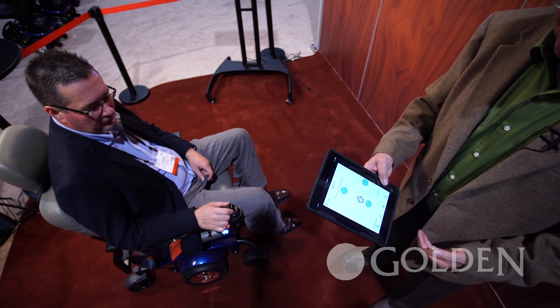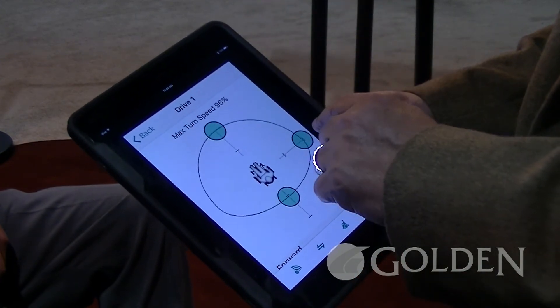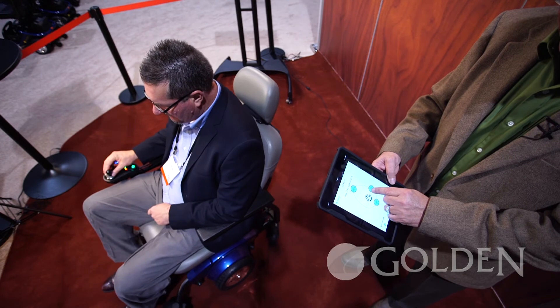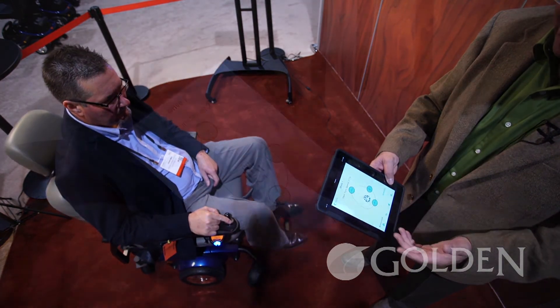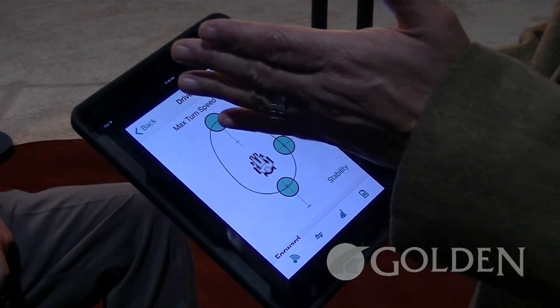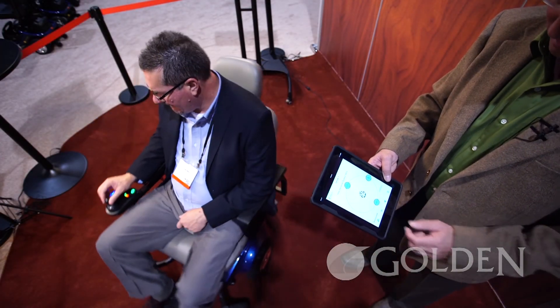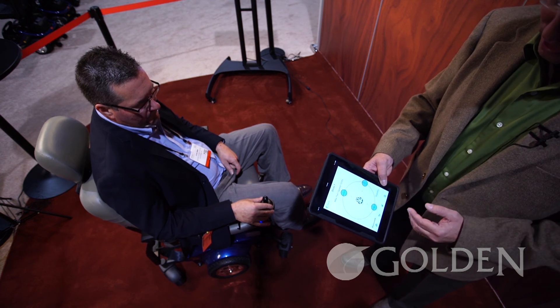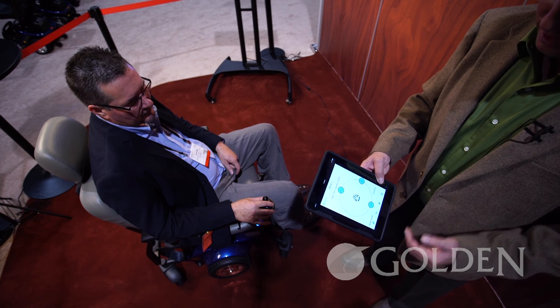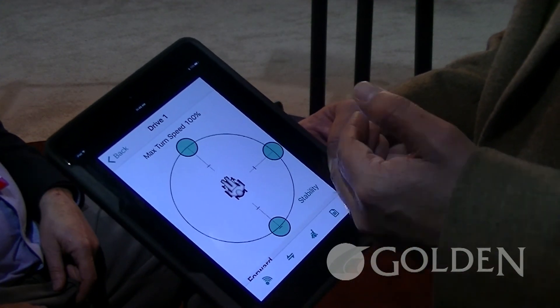Just one quick example of the driving parameters — no longer needing a handheld programmer, we're able to go with the access key, and something as simple as the turning radius. I am actually able to slow the chair down as the end user drives the chair throughout the house. As an example, a stroke victim going down a hallway, turning, transitioning on their bad side into a bathroom or bedroom — we're able to actually control the chair via a cell phone, iPod, or iPad 30 feet away. So you can really fine-tune the chair to the end user's needs, whether it's indoors or outdoors, being able to change the parameters of the drive system without spending a tremendous amount of time doing it.